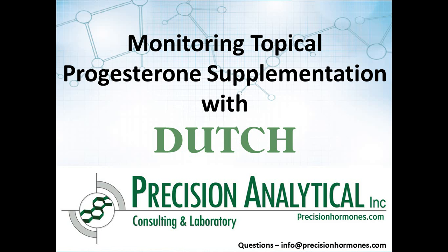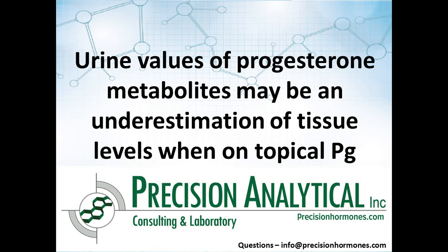This report tutorial is to assist you with your interpretation of your dried urine test for comprehensive hormones when patients are on topical supplementation of progesterone. And this is a particularly tricky scenario. Urine values of progesterone metabolites may be an underestimation of tissue levels when you're on topical progesterone.